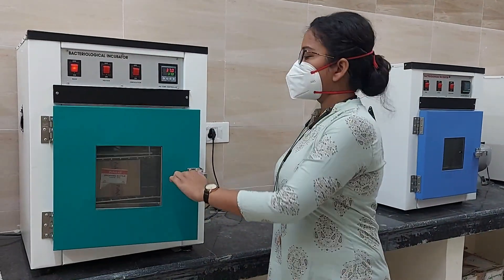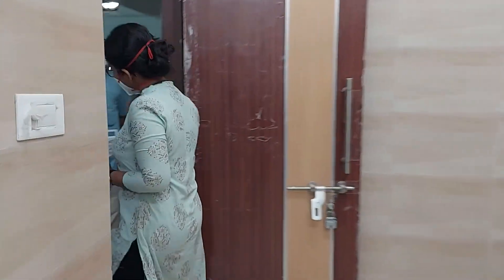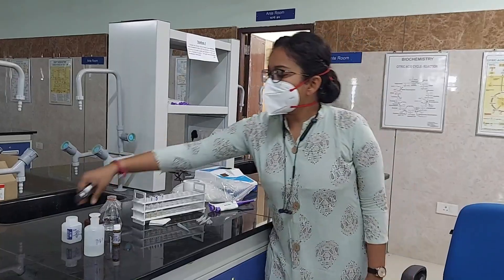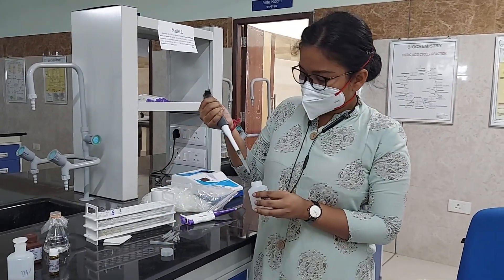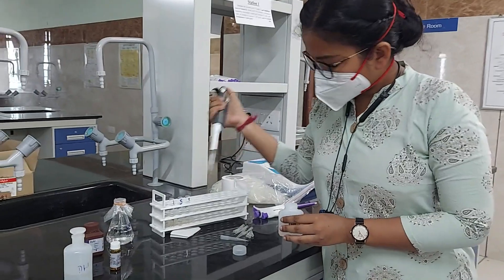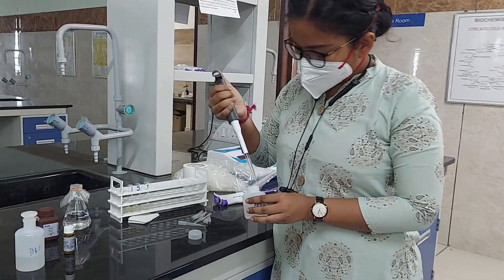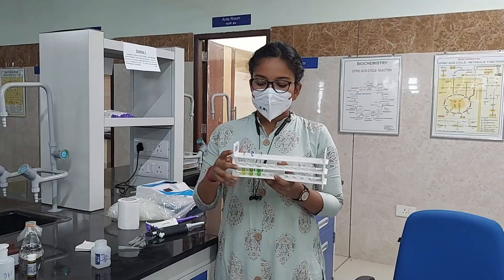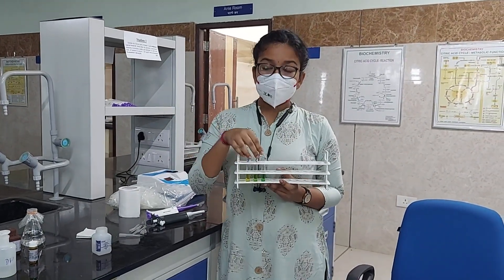Incubation is completed, so we are taking out the samples from the incubator. Now we have to add chromogen reagent — 1 ml each — in the test tubes: the blank, the standard, and the test. After proper mixing, we have to keep these test tubes in the incubator for 5 minutes at 37 degrees centigrade.